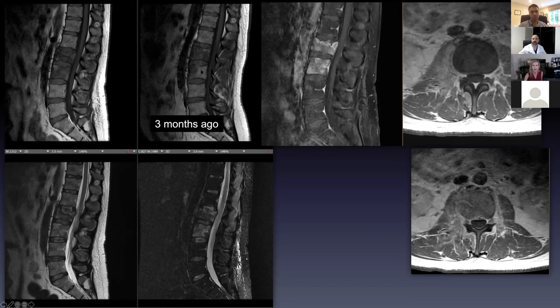So the interesting thing about this is he's had chronic back pain. Can you see my mouse? He has new acute back pain now, and this is a pathologic fracture that's developed in L2. Severe pain. The ID doc wants to know, what's the progression? How can we treat this? Kyphoplasty, which I said no because he's infected. Also, he has radicular symptoms on the right, and you can see why, because where the nerve roots come out at these levels, there's a lot of inflammatory material affecting his nerves.